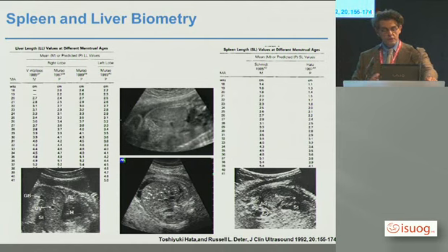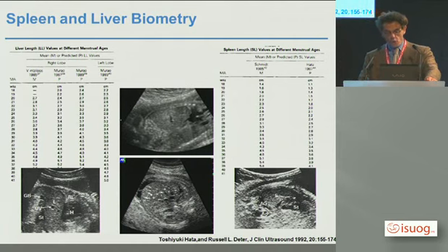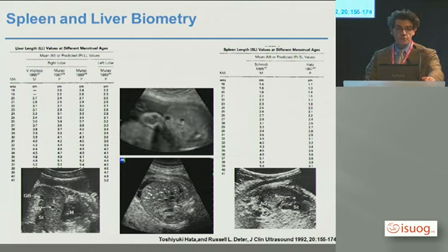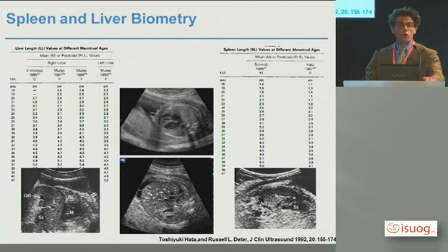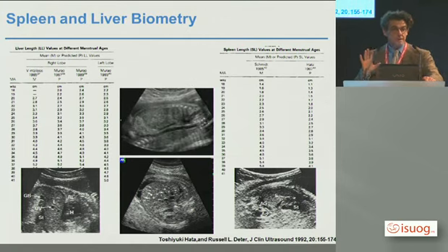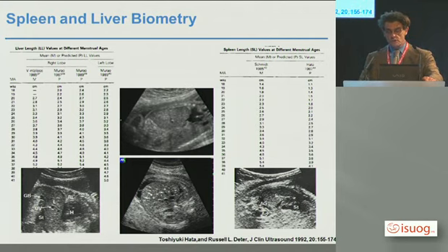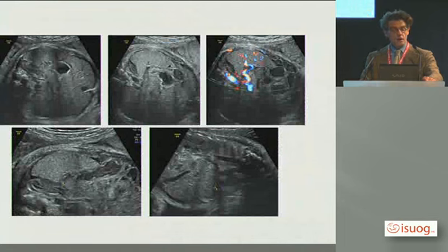If you want to look at the spleen, you go on an axial plane of the abdomen at the level where you would measure the abdominal circumference, but taking the full size of the stomach, so usually slightly above the usual abdominal measurement. And you will look, first subjectively, at the stomach.